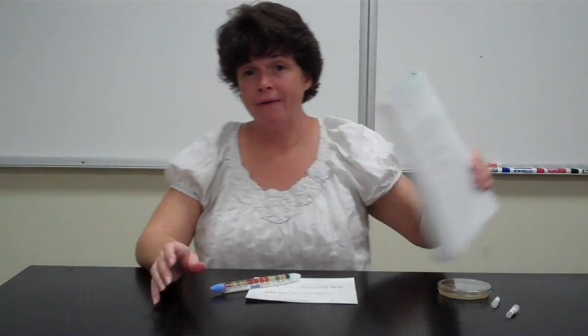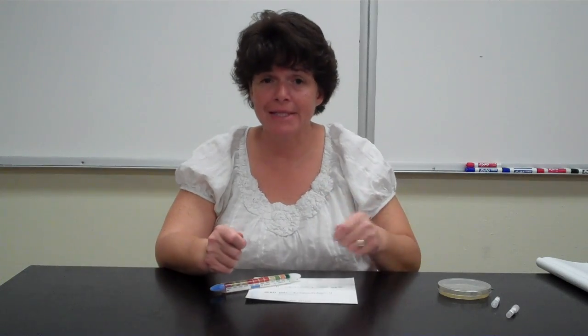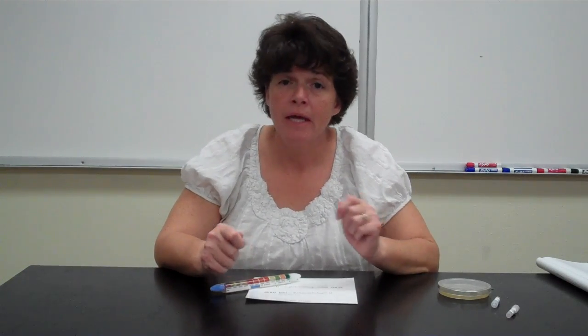And then with your 5-digit code, you come up to me and I have this booklet, and I couldn't find it today. Hopefully it will be here. I will look your code up in the booklet and it will tell me exactly what bacteria you have. Now, if the code doesn't match any of them, I'll have you bring your little guy up to me and we'll interpret the results together.